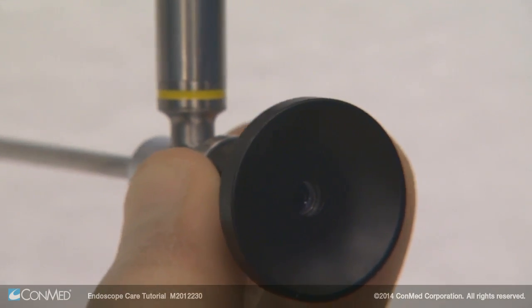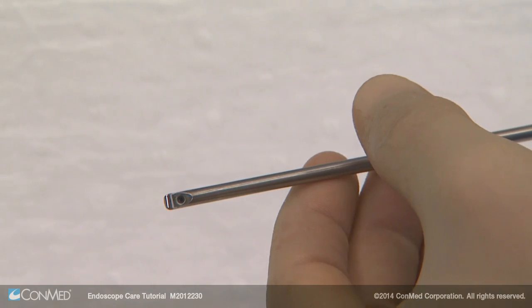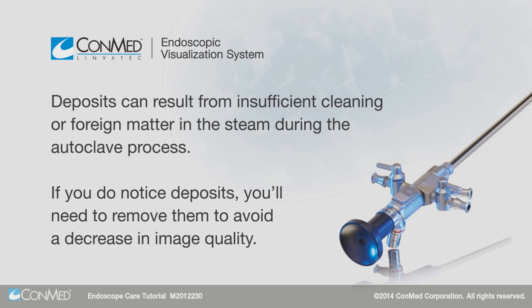Before use, always inspect and sterilize your endoscope to make sure it's free from damage, debris, deposits, and fingerprints on both the proximal and distal ends. Deposits can result from insufficient cleaning or foreign matter in the steam during the autoclave process. If you do notice deposits, you'll need to remove them to avoid a decrease in image quality.